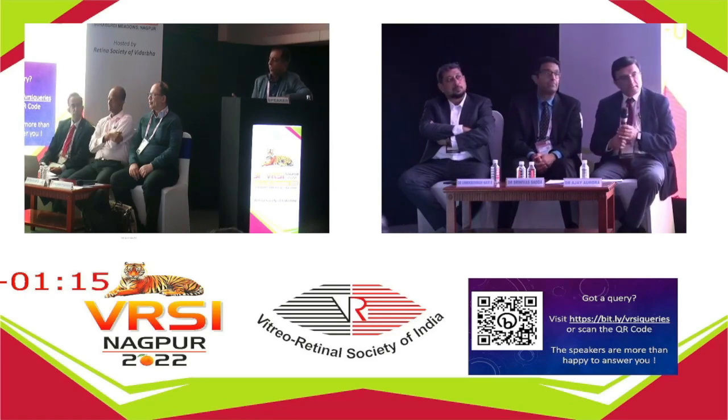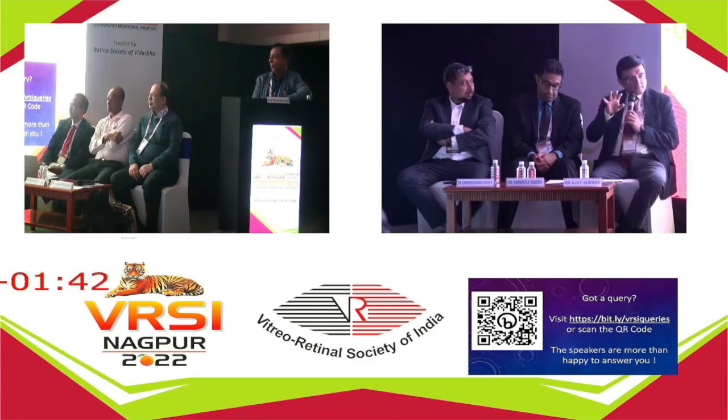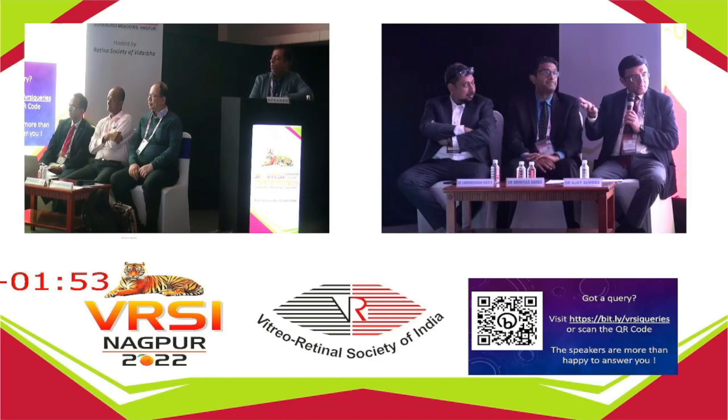I think the basic advantage is the whole flexibility across the board, where you have the patient sitting on one particular machine, and based on the diagnosis or what you need, you could play around with so many different ways of looking at the same lesion, and that may give you ideas, like how Uni was talking of the fishnet on the OCTA. You look and find patterns which would come up. The only problem with SLO based images is when you have somebody else working in the clinic and they'll say, oh my God, this doesn't tell me about the glaucoma findings so well.